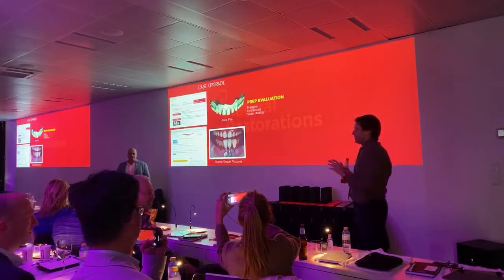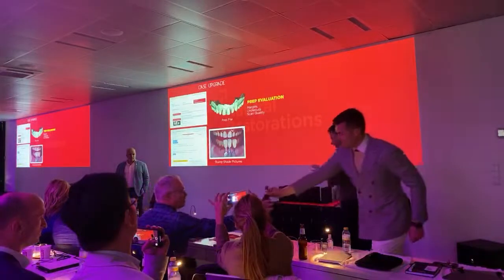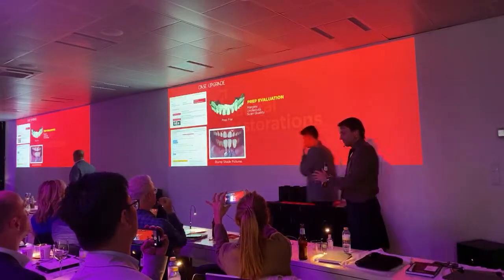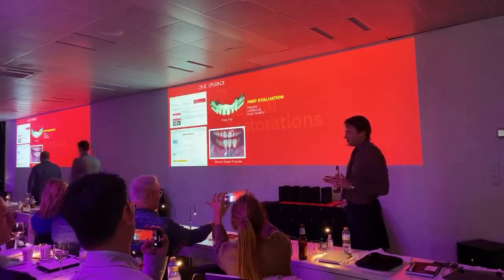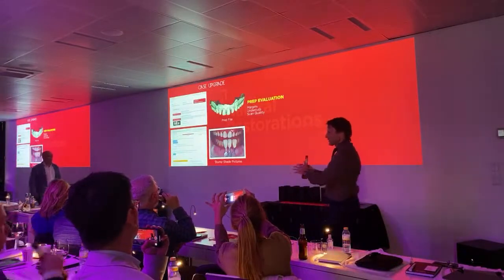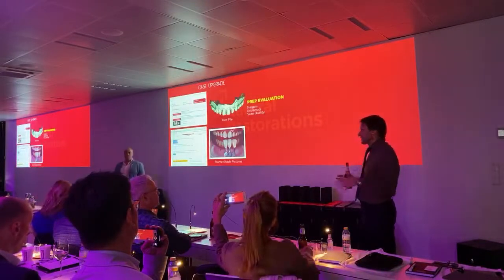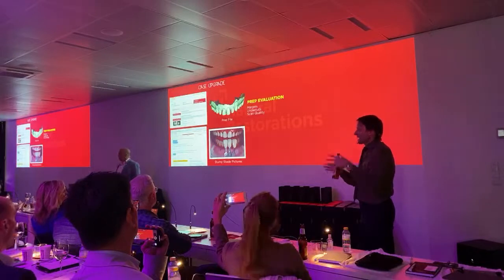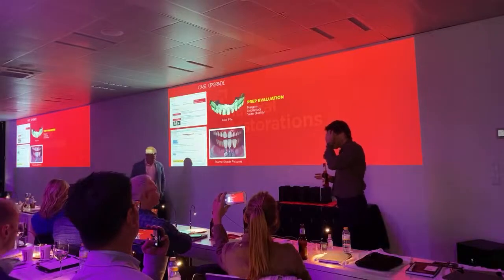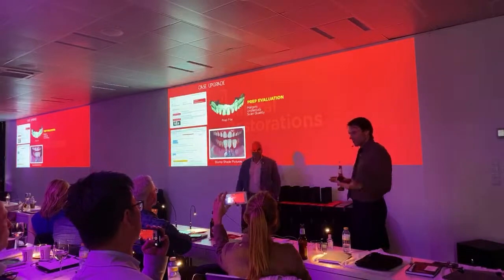The other two main reasons why CAD/CAM restorations will not work are distortion in the quality of your scan. Of course, scans are easier and more precise than regular impressions, but we still have art in scanning. And the other, that is probably the main one, is that the prep is not allowing the restoration to be manufactured. This is probably the number one reason. And it's not because dentists don't know how to prep, but because prepping is very, very difficult.